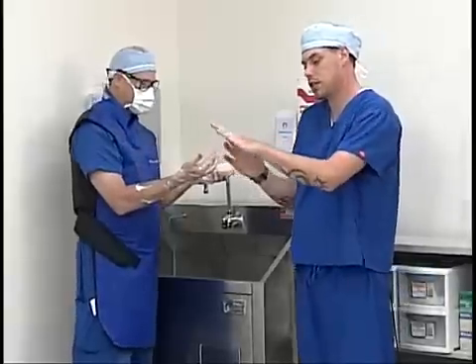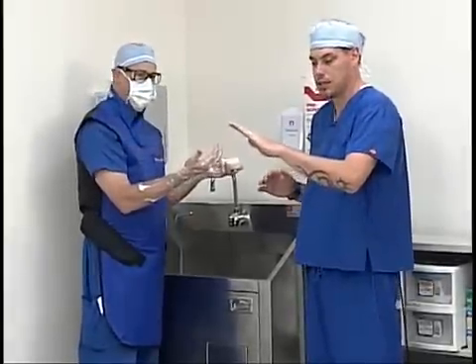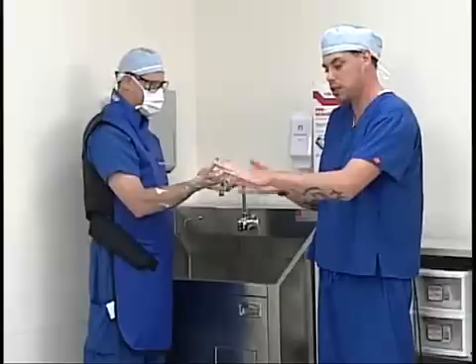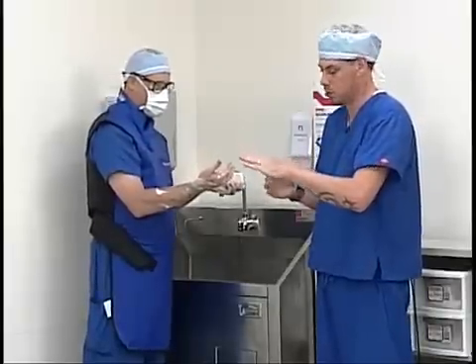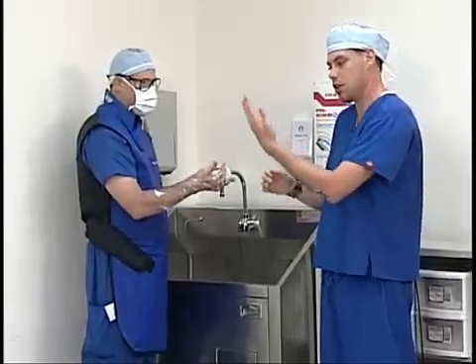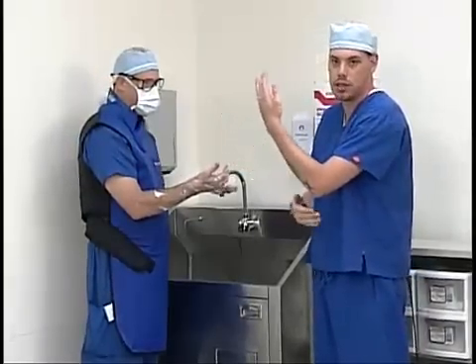Scott's going to need to imagine that his hand is like a box and it has four planes: the top being one plane, the bottom being another plane, and the sides both being an individual plane. Scott's going to scrub five times on each individual plane, starting from his fingertips and working down to his elbow.